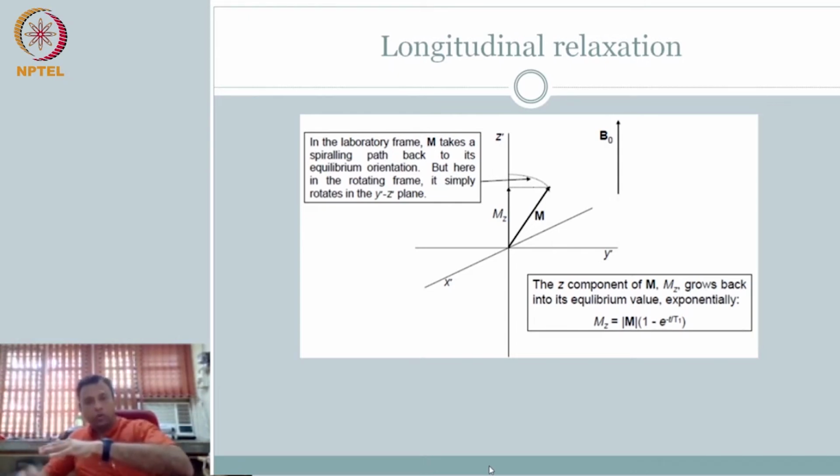Whoever is moving slow, you start to move fast. If I give that command, right, if I know how to do that, then what will happen? The slow ones will start to move fast, the fast ones will start to move slow, and therefore after you tell that command, within a short time, they'll start to become coherent again, right? Again, after you finish that command, they will have their own ability to dephase again.